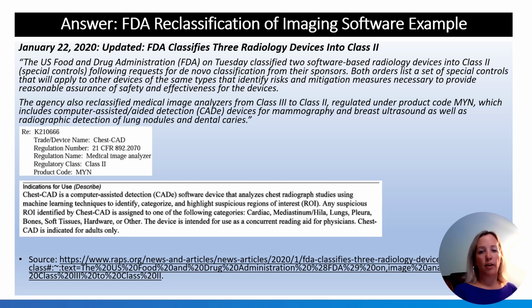Safety and performance outcomes, I would look at the FDA database and look at the summaries of the 510Ks, kind of see what they did to justify the safety and effectiveness of their software for these different medical image analyzers. Of course, some of them might have gone the extra mile since they were writing a PMA for a class 3 device if it was prior to 2020. So you might want to consider the devices that have been approved since 2020 as they submitted a 510K because they knew they would be class 2.